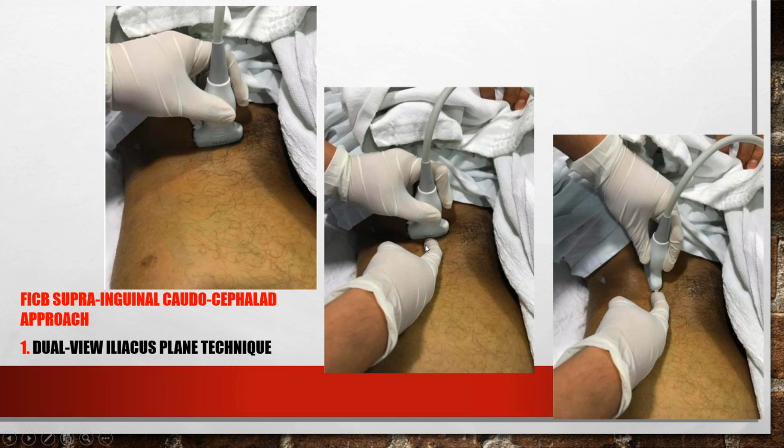Then we mark with the finger here the middle point of the transducer, and rotate the probe horizontally to the axis. Imagine that this finger is the injection point of our needle. So this is the dual view iliacus plane technique.